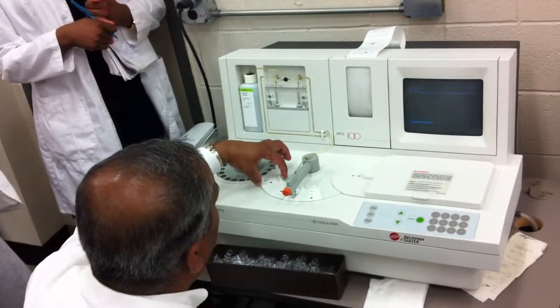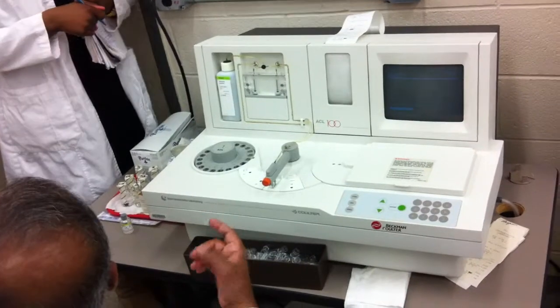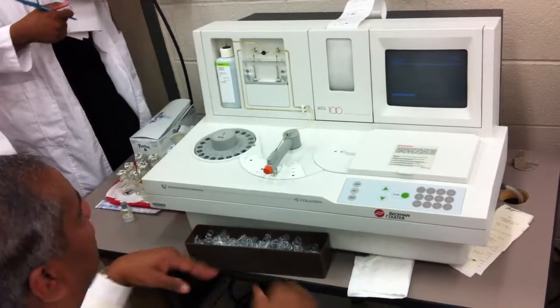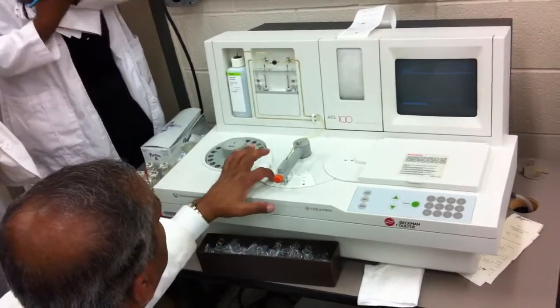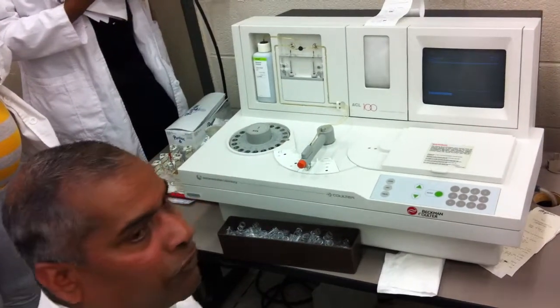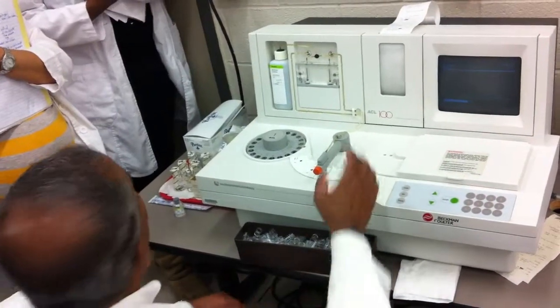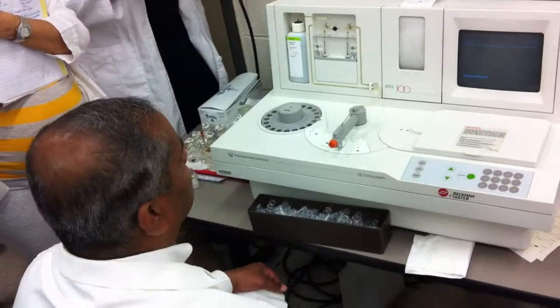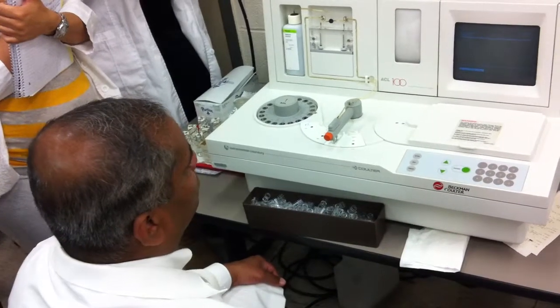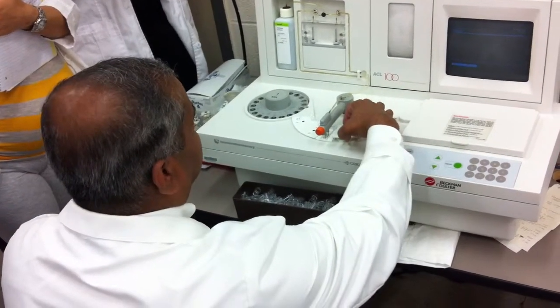All right? So those little spinners, what does that do? Keep mixing it, right? If you leave it, it settles out. Remember I told you, these two little reagent containers are refrigerated. So it stays cool. Calcium will not spoil. So calcium, you don't need to refrigerate. Nor is there a spinner in there, okay?